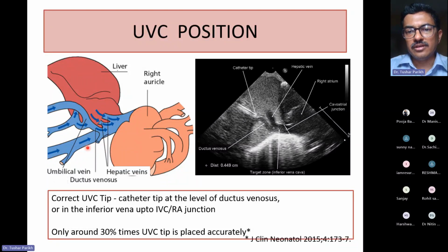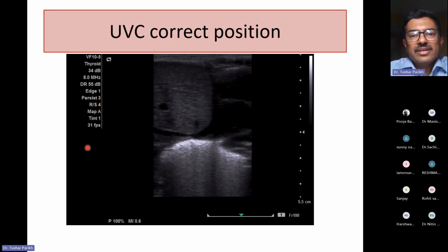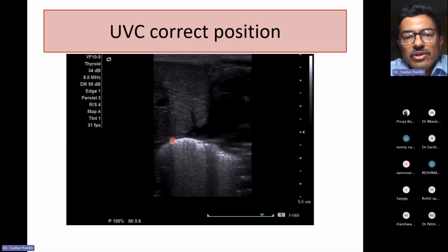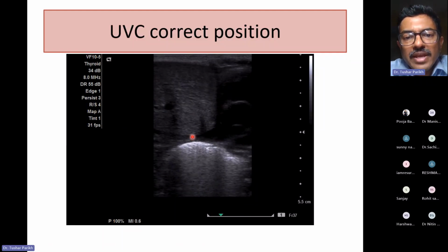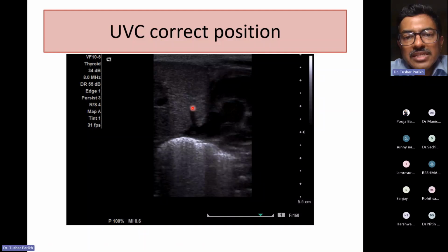Okay. Yeah. So let's move on. Just showing you an example here. I think this is an image, but I don't know if you're able to see. Here is the tip of the line. So this is a hepatic vein. This vertical vein is a hepatic vein. This particular one is a hepatic vein.